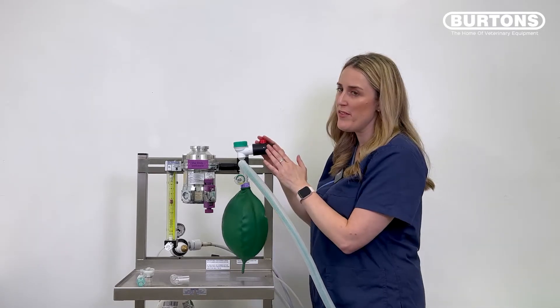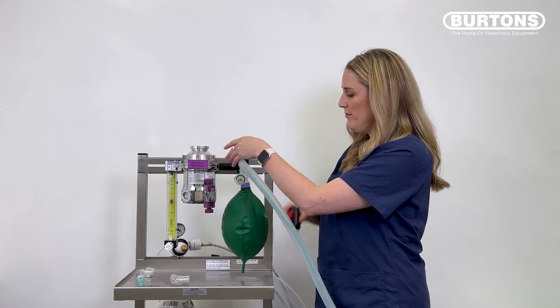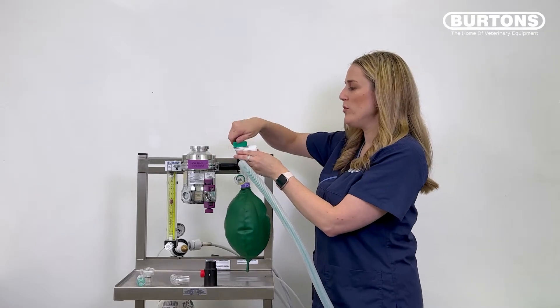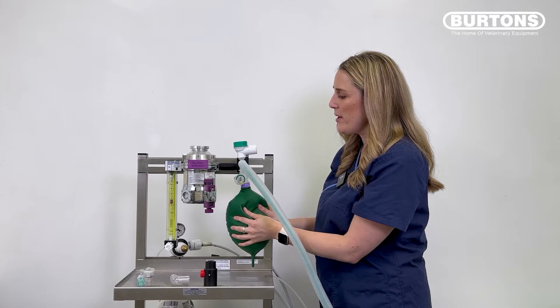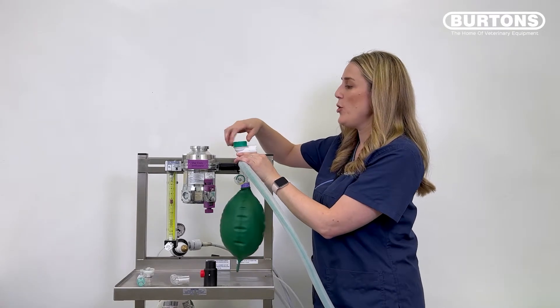Now, if you don't have the IPPV button valve, you can just do as you would normally and close the APL valve and give that breath and then open it back up again.